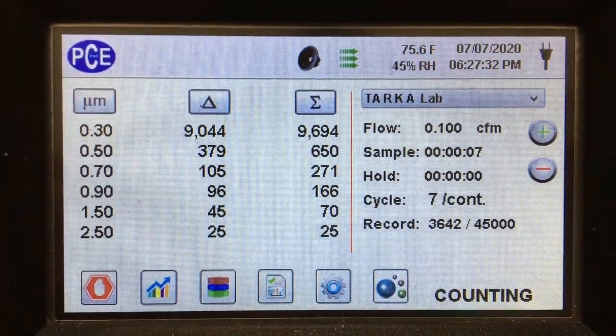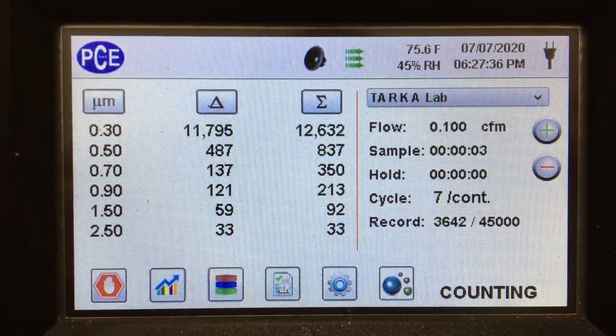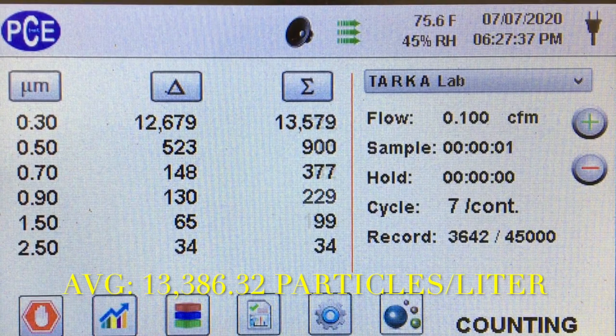You can see the count going up and we get an average of around 13,386.32 particles per liter. We did about 30 samples and this is the average we got.